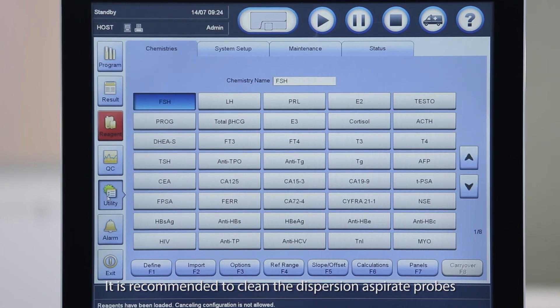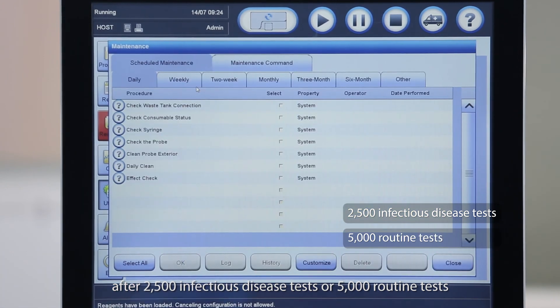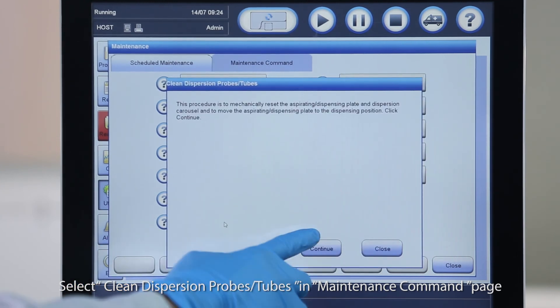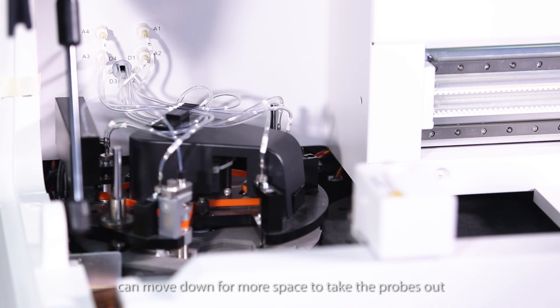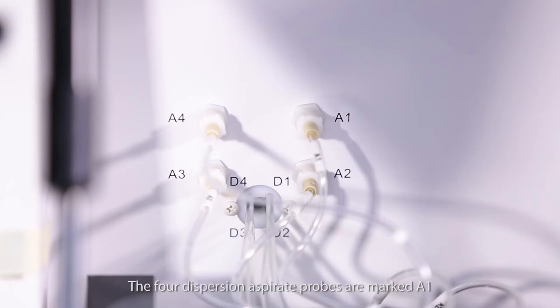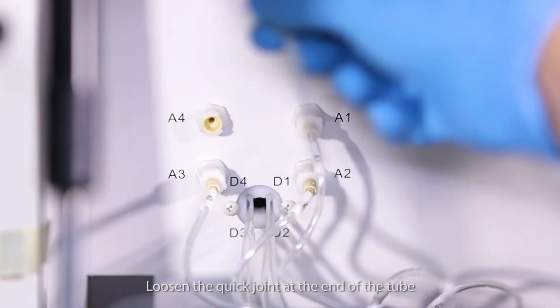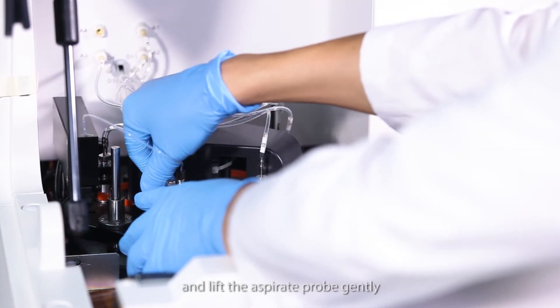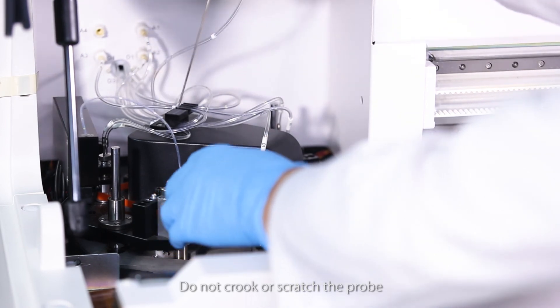It is recommended to clean the dispersion aspirate probes after 2,500 infectious disease tests or 5,000 routine tests. Select Clean Dispersion Probes in Maintenance command page. Click Continue so that the dispersion disk can move down for more space to take the probes out. The four dispersion aspirate probes are marked A1, A2, A3 and A4 respectively. Take A4 as an example. Loosen the quick joint at the end of the tube. Unscrew the round screw of A4 aspirate probe and lift the aspirate probe gently to remove it from the dispersion carousel. Do not crook or scratch the probe.